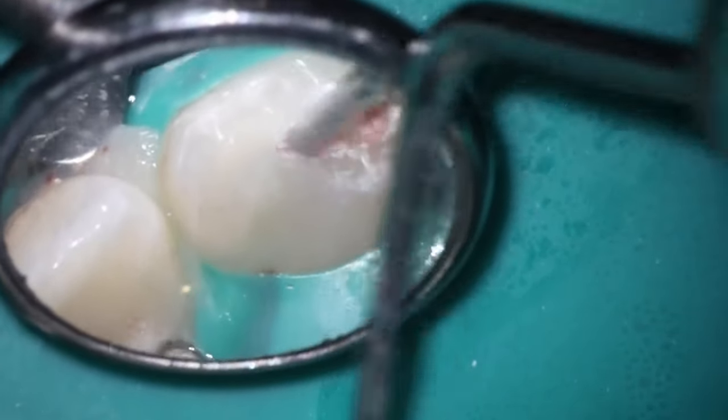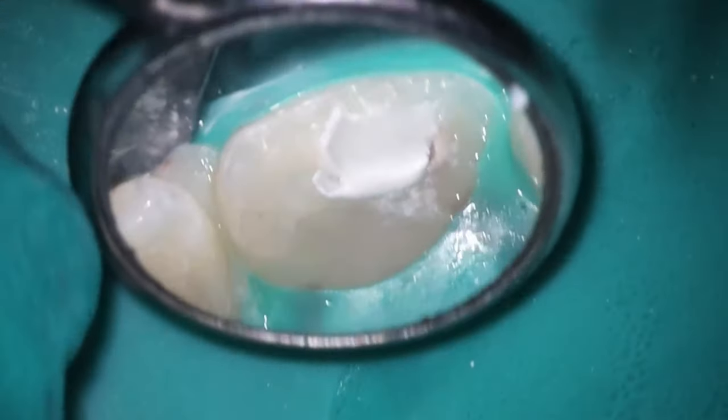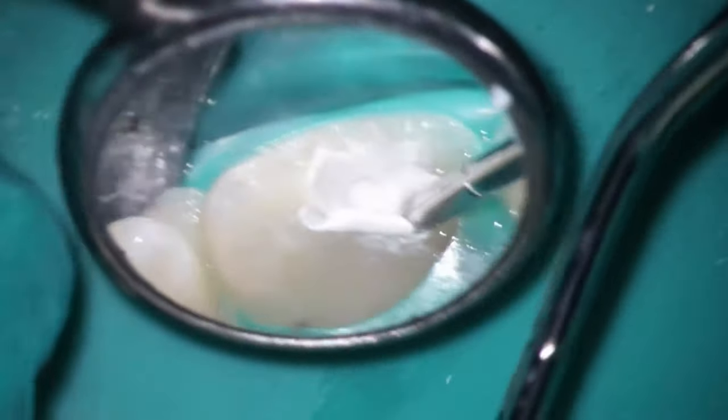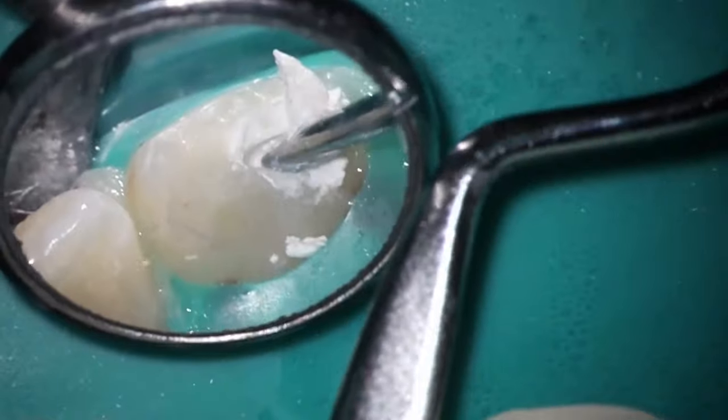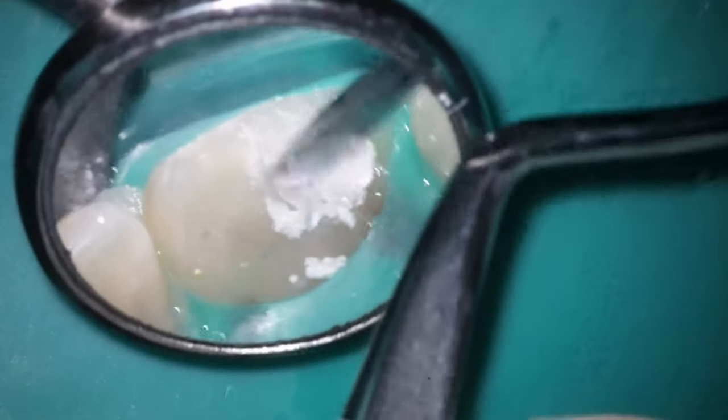With our modern materials, we can probably get away with a little bit more, but because I just have problems with IRM causing really nasty necrosis, I felt it was better in this case to remove a little bit more, be a little more aggressive on the removal of the actual pulp tissue, because we can fill this up with a nice BC putty and just get a really rock solid result here. So I'm gonna pop that in here.